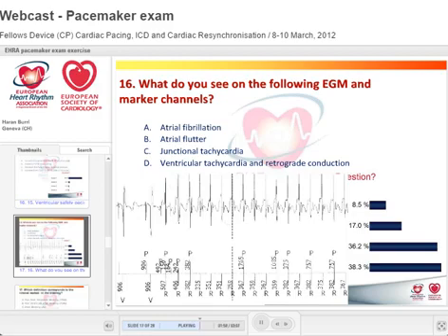How can you prove it's not ventricular tachycardia? I cannot prove it, but it's highly likely because your tachycardia starts off with an atrial event. This is sometimes what's used by ICDs. They see where the tachycardia started. It started in the atrium. Very clearly, you have this sinus beat, and then two premature beats that then set off the tachycardia.